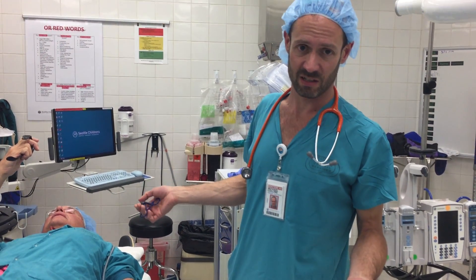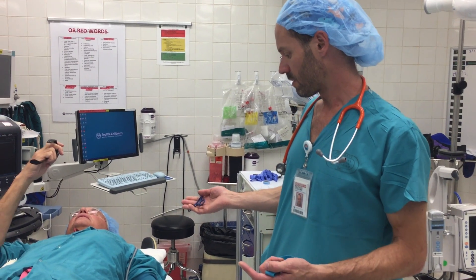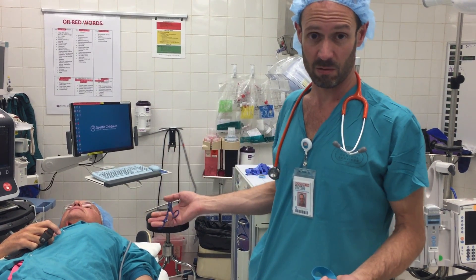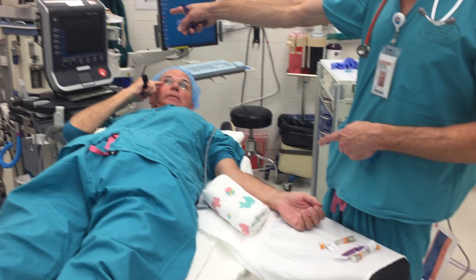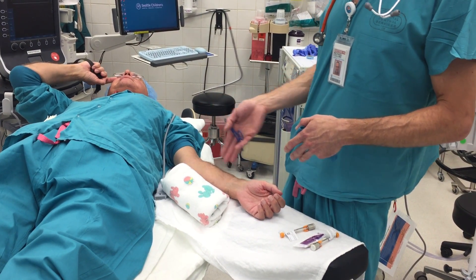Straight line, in-plane technique of getting venous access. The first and most important part of this is getting the setup right. I have a seat, and I have the ultrasound in a straight line with the direction I'm going to be placing the needle.